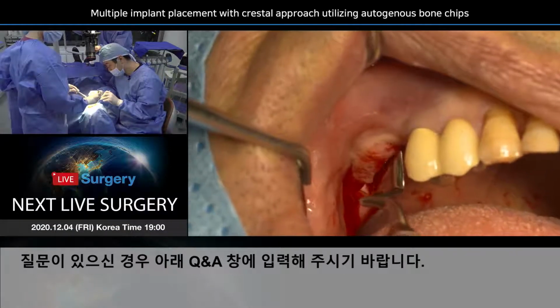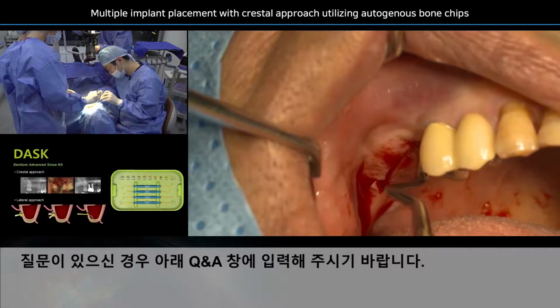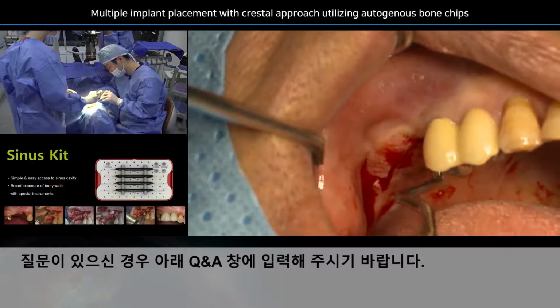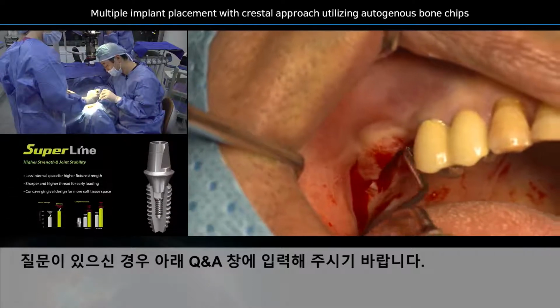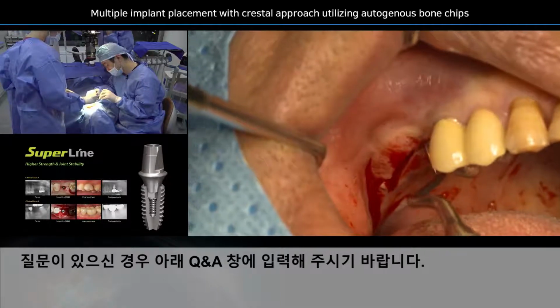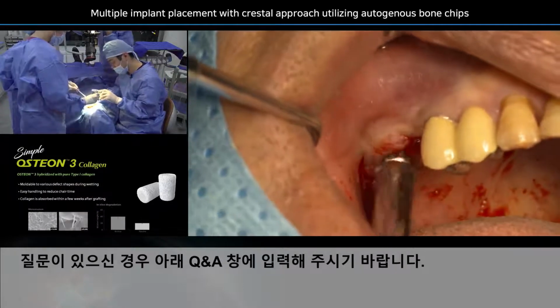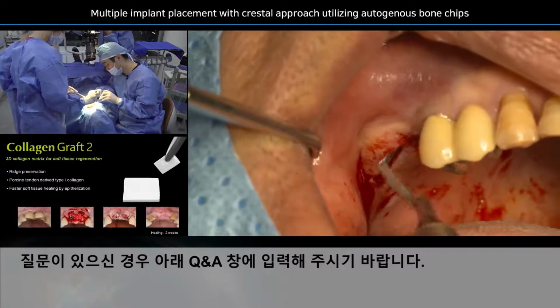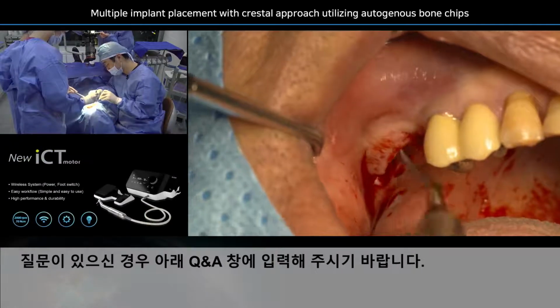You follow the flap and then cut the periosteum. If the soft tissue has inflammation or infection, it is very difficult to properly cut. So this Orban knife helps you to properly cut the periosteum. Do you see that the Orban knife is going deeper and deeper, moving back and forth, right? So you do not really retract the whole flap, but you create a space to put your periosteal elevator. So you reverse the Orban knife and you approach the palatal aspect. You do the same thing. You go back and forth, and properly detach the periosteum.